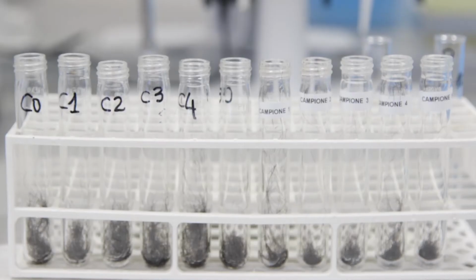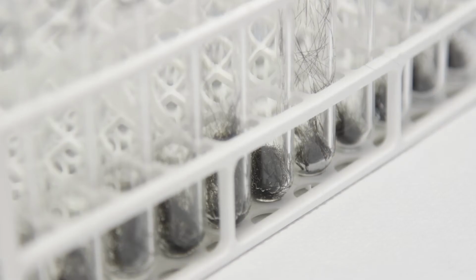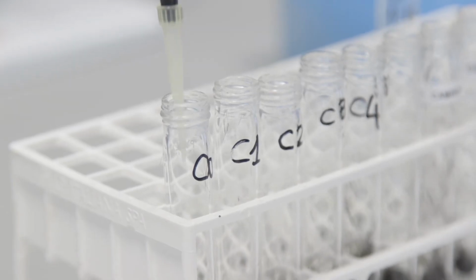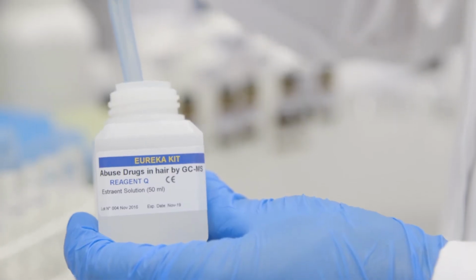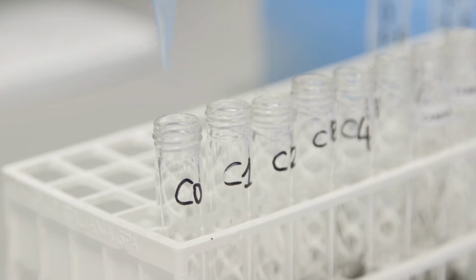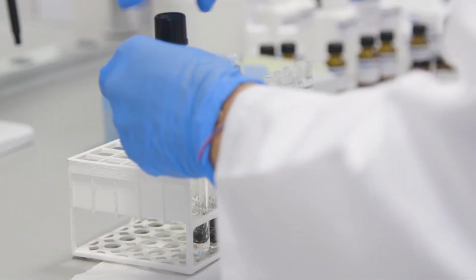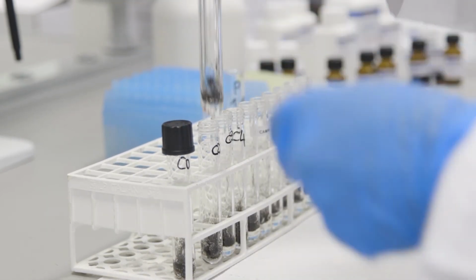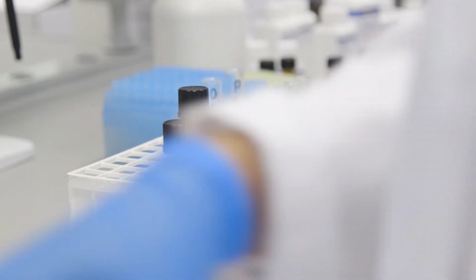We proceed with the digestion of the molecules of the hair. In every tube previously prepared, you add 25 microliters of diluted reagent O, 25 microliters of diluted reagent P, and 1000 microliters of reagent Q, extraction solution. Close the tubes tightly and gently mix and flip them for 10 seconds. Then put in the oven at 45 degrees Celsius for 18 hours.